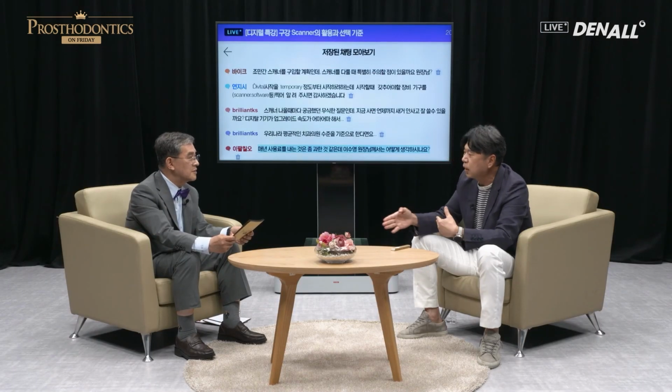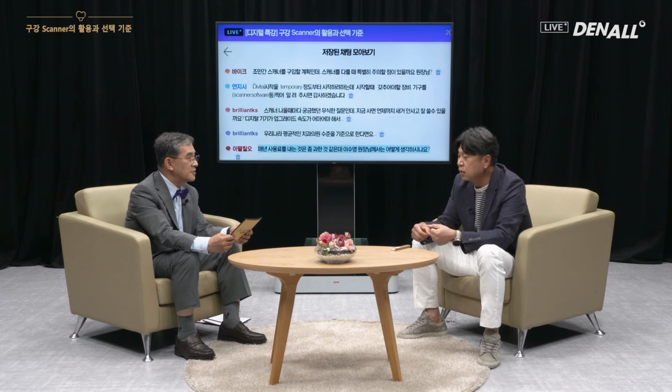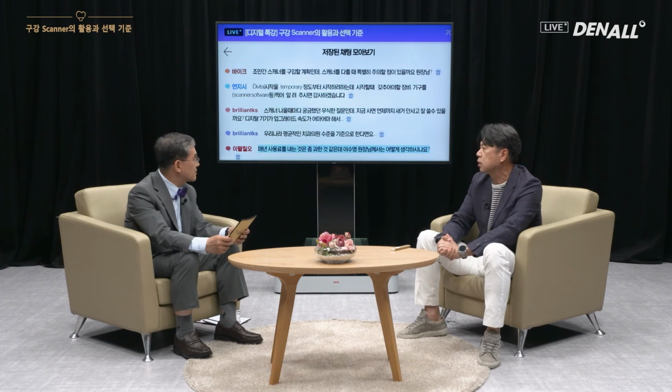The firmware, which is in between the hardware and software, it is not soft, it is not hard, but it is the middle level. The firmware is being updated constantly to optimize the device. The same device 3 years ago is quite different from today in terms of the performance. The fee-imposing companies maintain the firmware constantly to keep it up to date. And the other option is you pay for the firmware software upgrade. So that's the difference between the two options, and you need to consider the pluses and minuses. If you want to keep up-to-date the status by forcibly paying the fee, or you want to have the freedom for the upgrade, even though you pay for it.